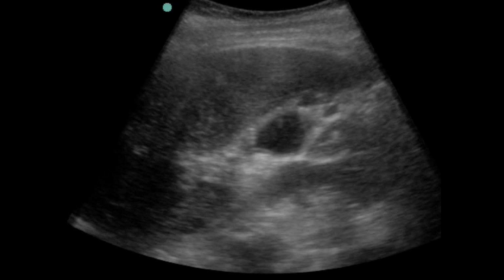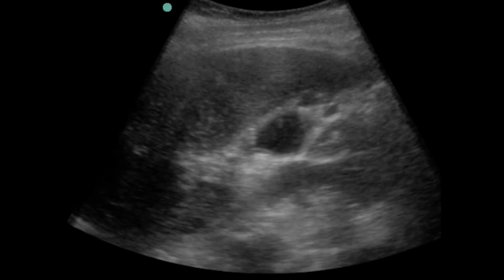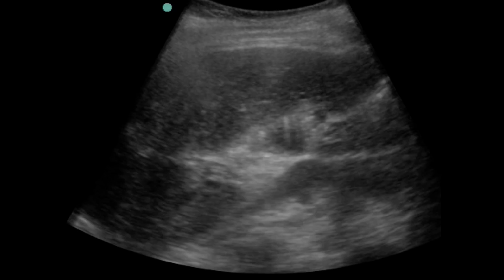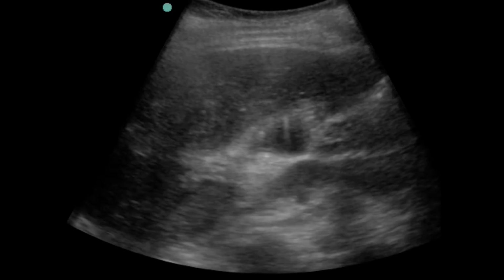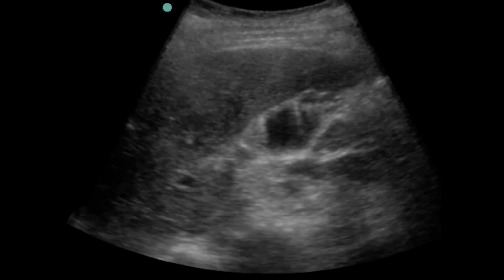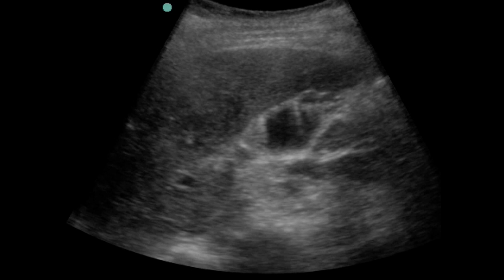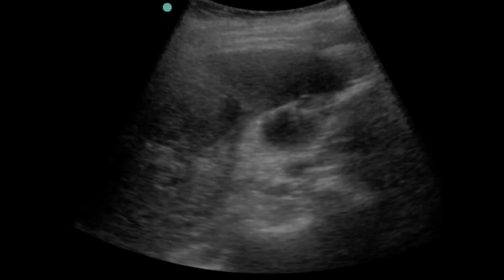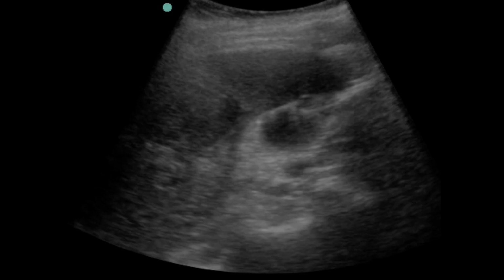Again, gallbladder sitting right in that crevice of the liver, anechoic. You see these little bright lines shooting down from the top of the gallbladder wall. If you didn't know what these were, you'd think that maybe they're stones, but then stones shouldn't stop. They should shadow all the way down. These look like little shimmering artifacts. What these are is something called, bear with me now, Rokitansky-Aschoff sinuses. Basically, it's cholesterol crystals that form in the gallbladder wall. It's something called adenomyomatosis. Again, normal variant, but you will see it as you start to do more gallbladder ultrasounds. Those little shimmering lights come from the top of the gallbladder wall in this case.